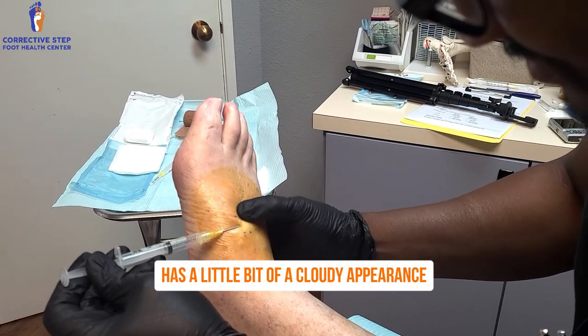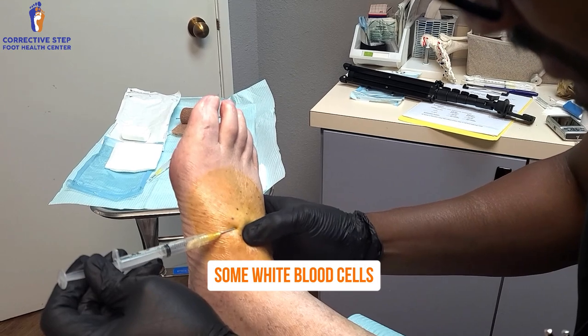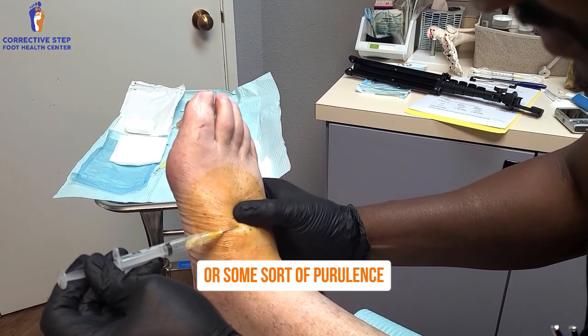You see it's kind of thick and chunky. It has a little bit of a cloudy appearance, which means there might be some white blood cells — in this case you would call that pus or some sort of purulence.